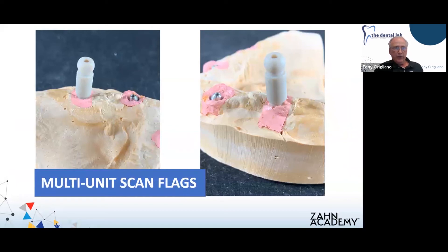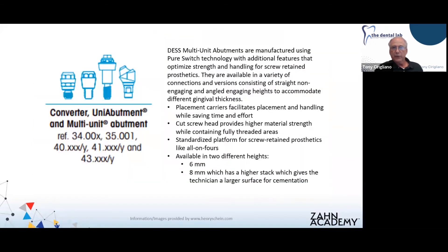Here are some of the components we'll be using in the fabrication of this case. On the left is your multi-unit scan flag; in the middle, the multi-unit tie base with the screw; and the multi-unit analogs. Here you see the multi-unit scan flag on the model in place. If you're familiar with the design process, you don't need to get a scan flag for every implant location — it's okay to move from one to the next, as long as you're dealing with the same restorative platform.